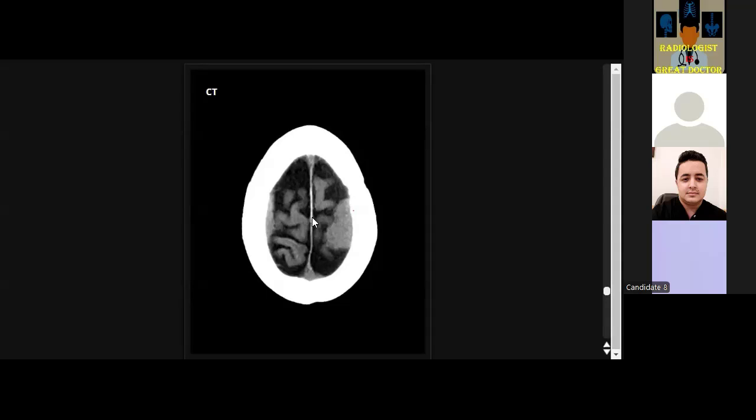You mentioned hemangiopericytoma, but unlikely in the setting of this appearance. So it's meningioma, it's dural metastasis, it's dural lymphoma. Lymphoma and metastasis can be in the form of a lesion or dural thickening, meningitis.